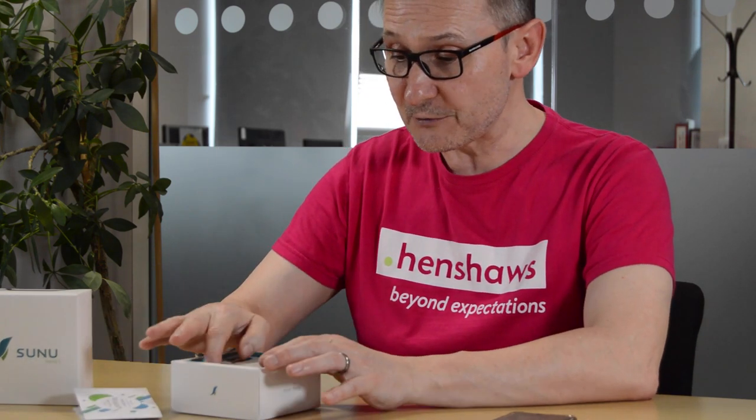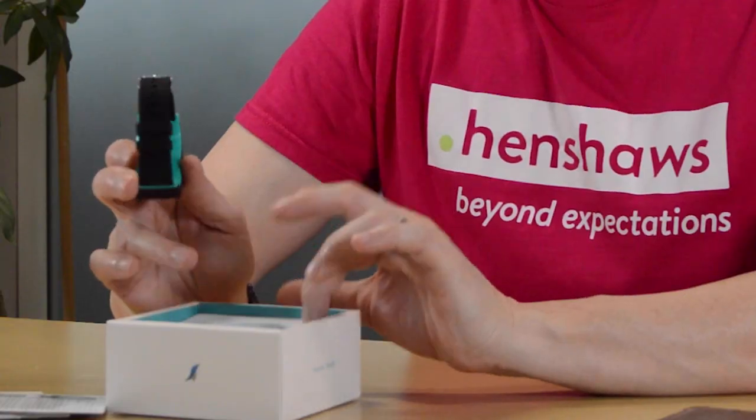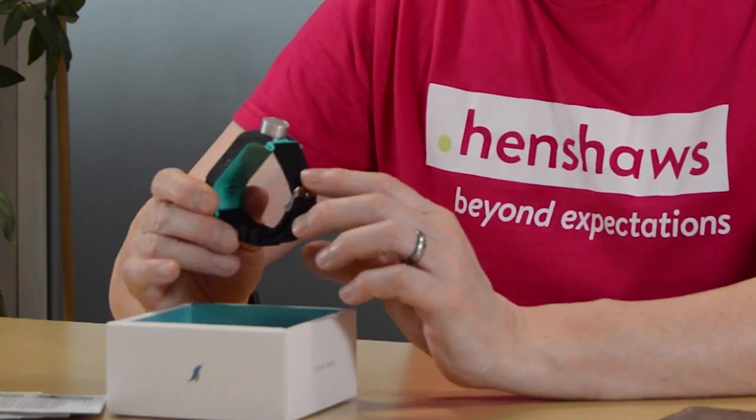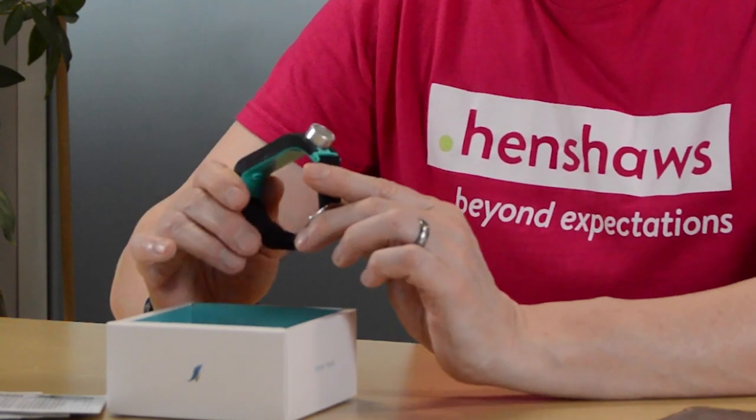What it comes with is a nice little card that says 'Life is either a daring adventure or nothing' — that's from the famous Helen Keller, and it's in Braille as well, so nice touch there Sunu Band. The main event is the device itself; you also get a charging lead in there, not a charger — that's being left out by people now — just a charging lead.